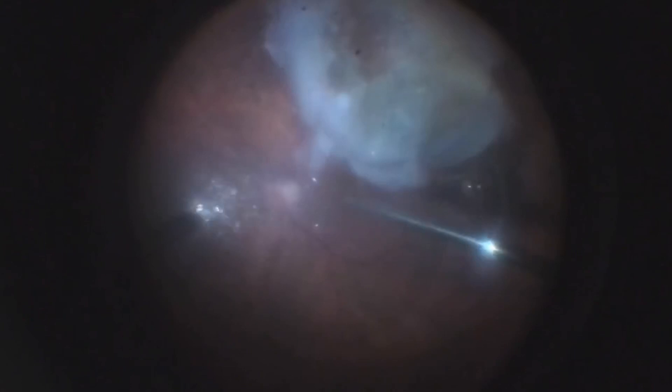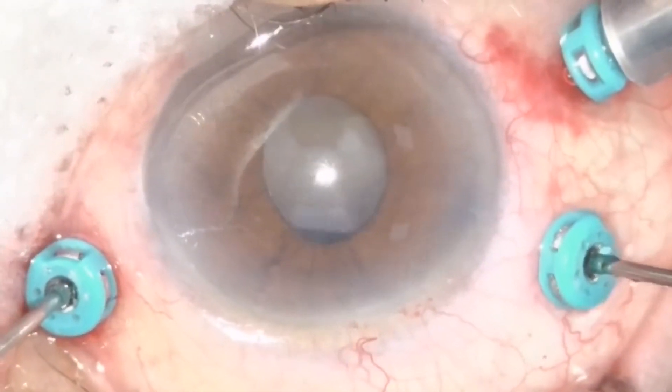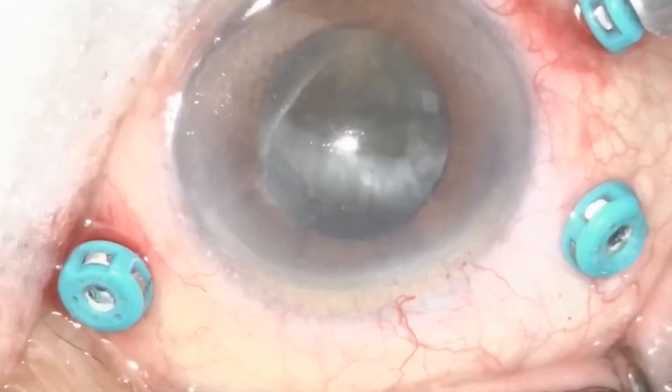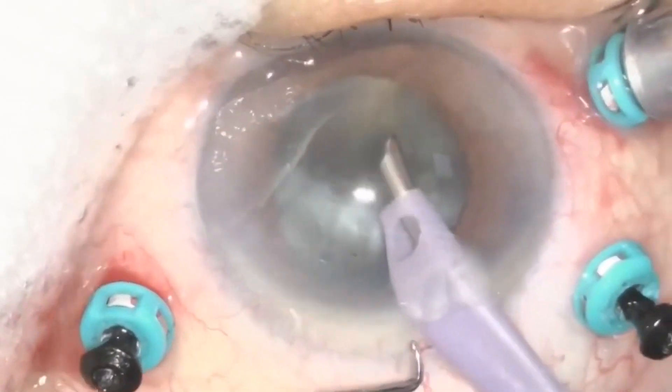The surgeon injects perfluorocarbon liquid to fill the vitreous cavity, bringing the nucleus to the pupillary plane. Sometimes the fragment stays behind the iris, so you can use scleral depression to help place it in the correct position. It is important to use a valved system or place plugs in the trocars to avoid leakage, PFCL loss, or nucleus dropping.